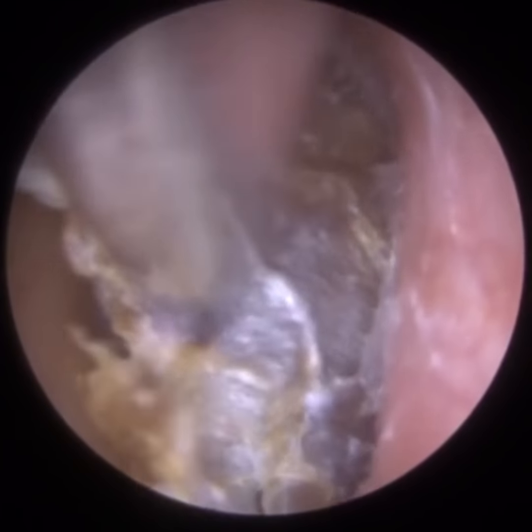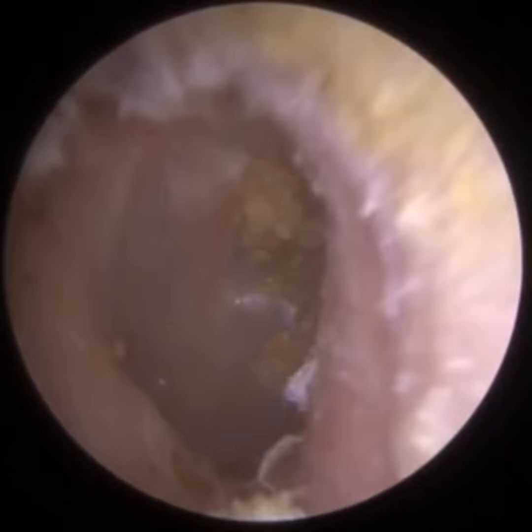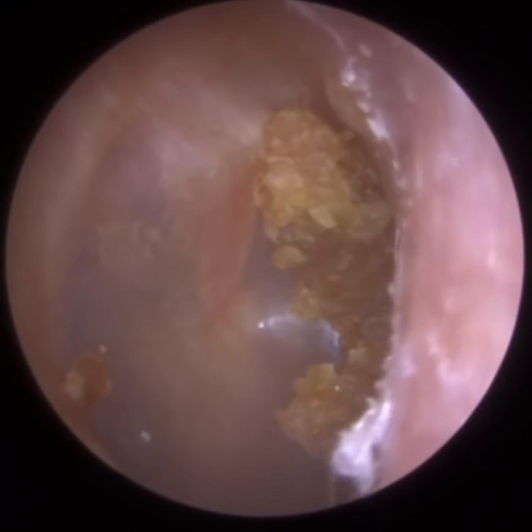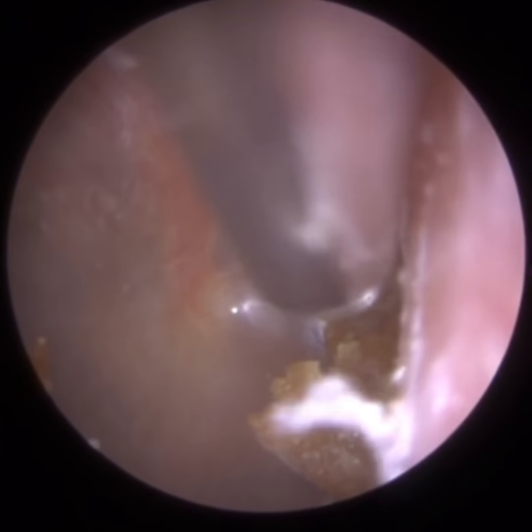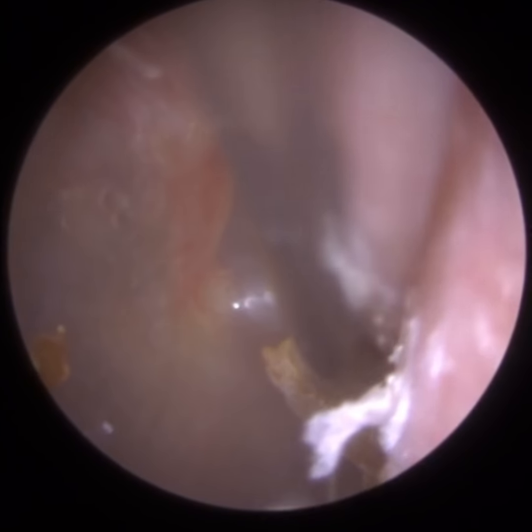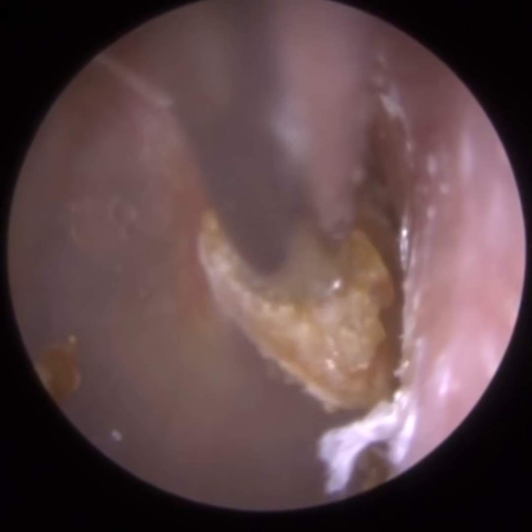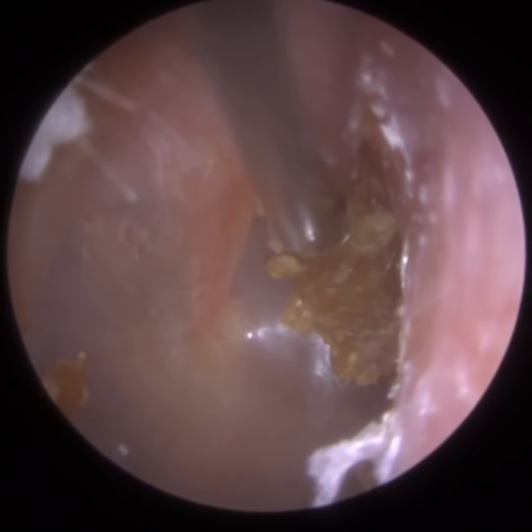So as that skin multiplies, duplicates itself as a process. So I'm just removing this plug off the eardrum. As this freshest most layer that's tightly adhered to the canal wall duplicates itself in a process called mitosis, we call that a sister cell that's created, and this sister cell pushes upwards the original parent cell. So this original skin that was lining the ear canal is no longer directly on the ear canal, it's been pushed up by its sister cell. Therefore, it gets further away from the blood vessels, and therefore the skin becomes a bit drier.